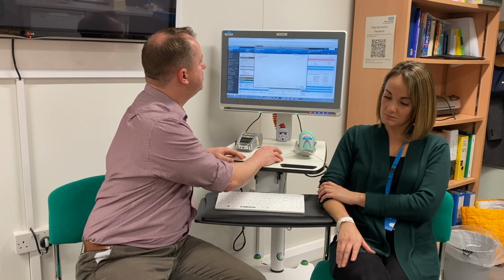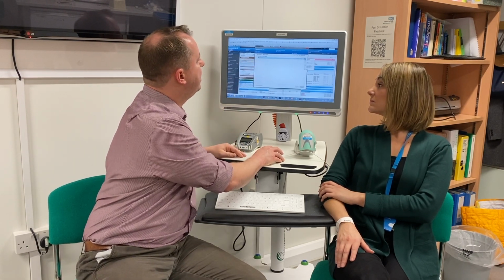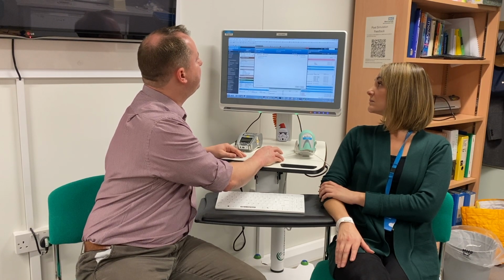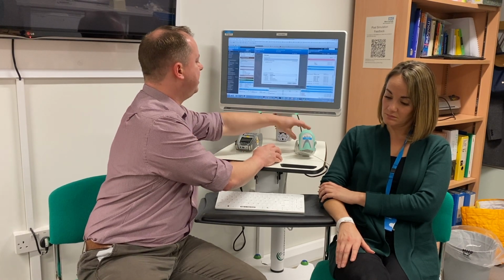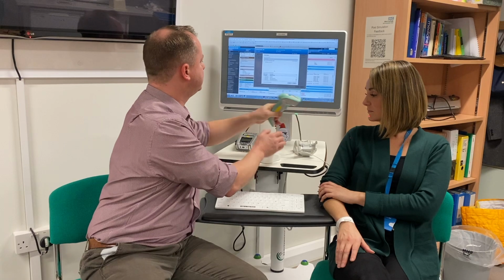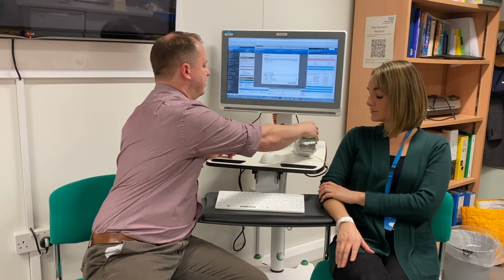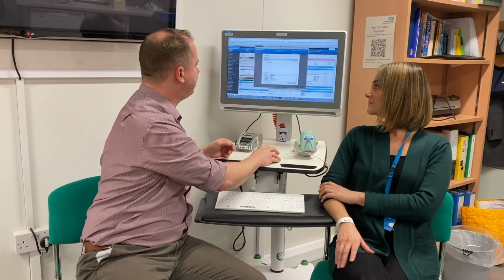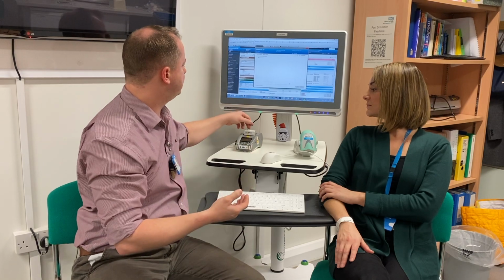And so what we would want to do is first of all come to the sample that we took, so this was a brown bottle, and say collected. Then I would want to make sure that I print my labels, and then find the correct printer that I was going to print from. I can take my scanner, scan my printer, or I can find it in the list if I really wanted to, and then I could print off my sample, and it would print off my label.